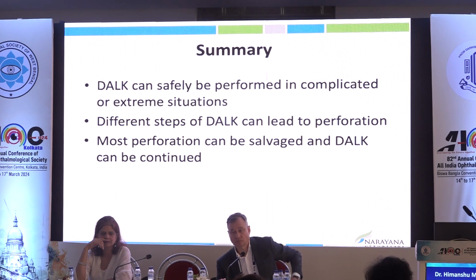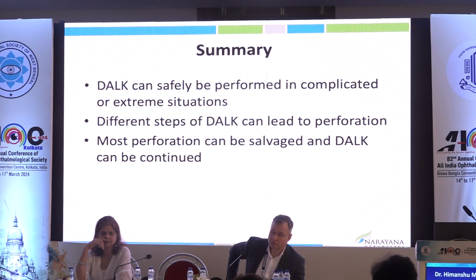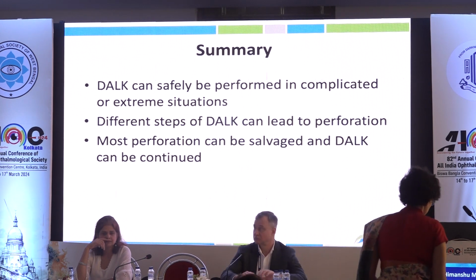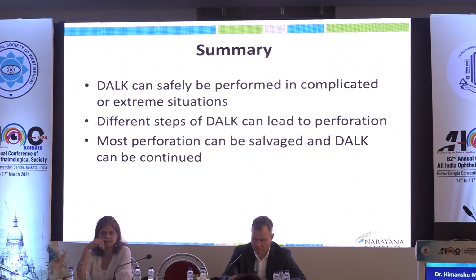So DALK can safely be performed in complicated and extreme situations. Different steps of DALK can lead to perforation, but most of the time you may be able to salvage these cases. Thank you very much.